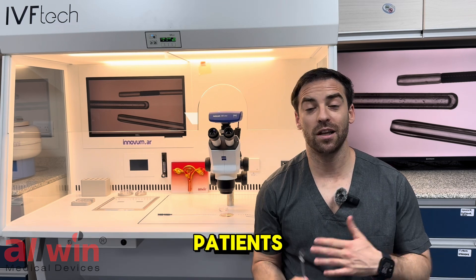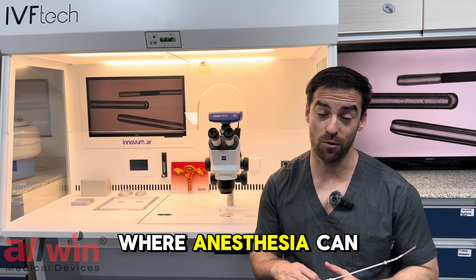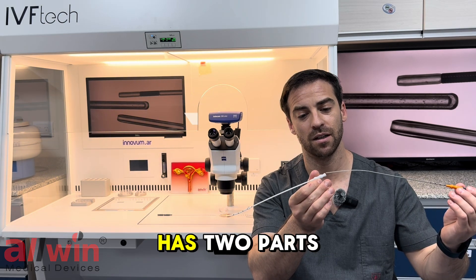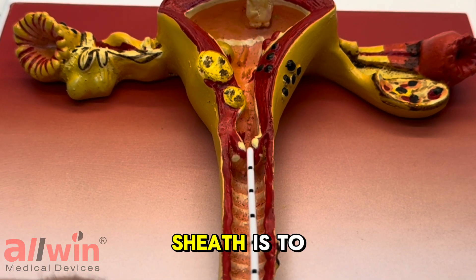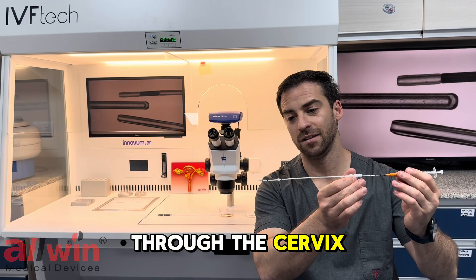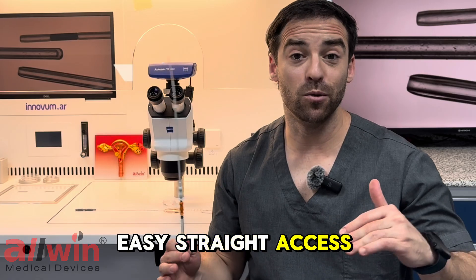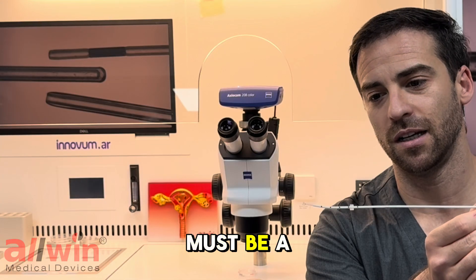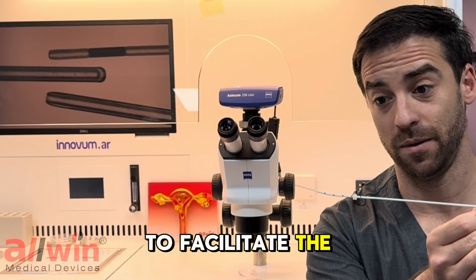There is no harm to the patients, although there are some exceptions where anesthesia can be required. As mentioned, embryo transfer catheters have two parts. The main function of the outer sheath is to get access through the cervix. Sometimes it's an easy straight axis, but some cervixes have curves that may complicate the access, so the sheath must be a little bit stiff to facilitate the entrance.